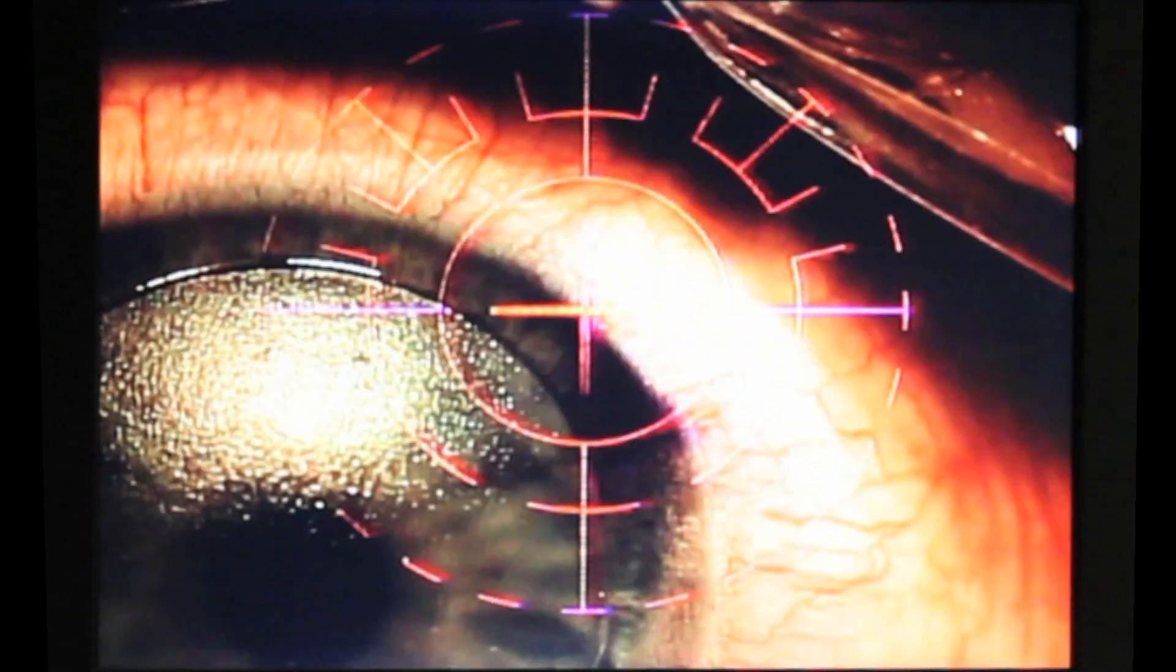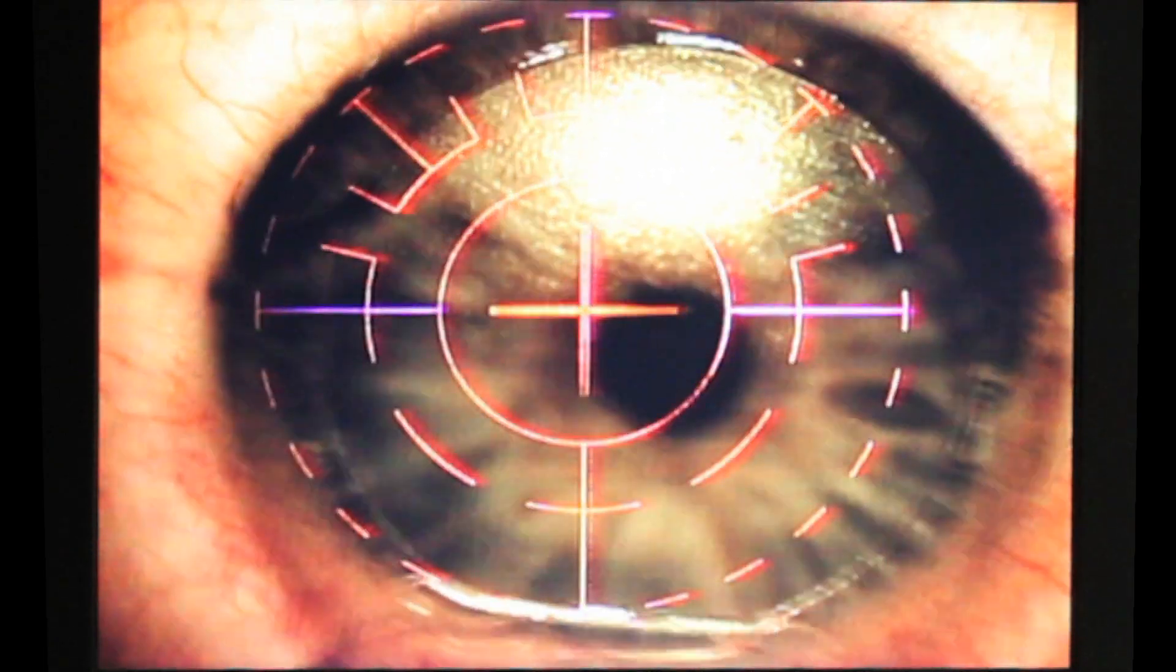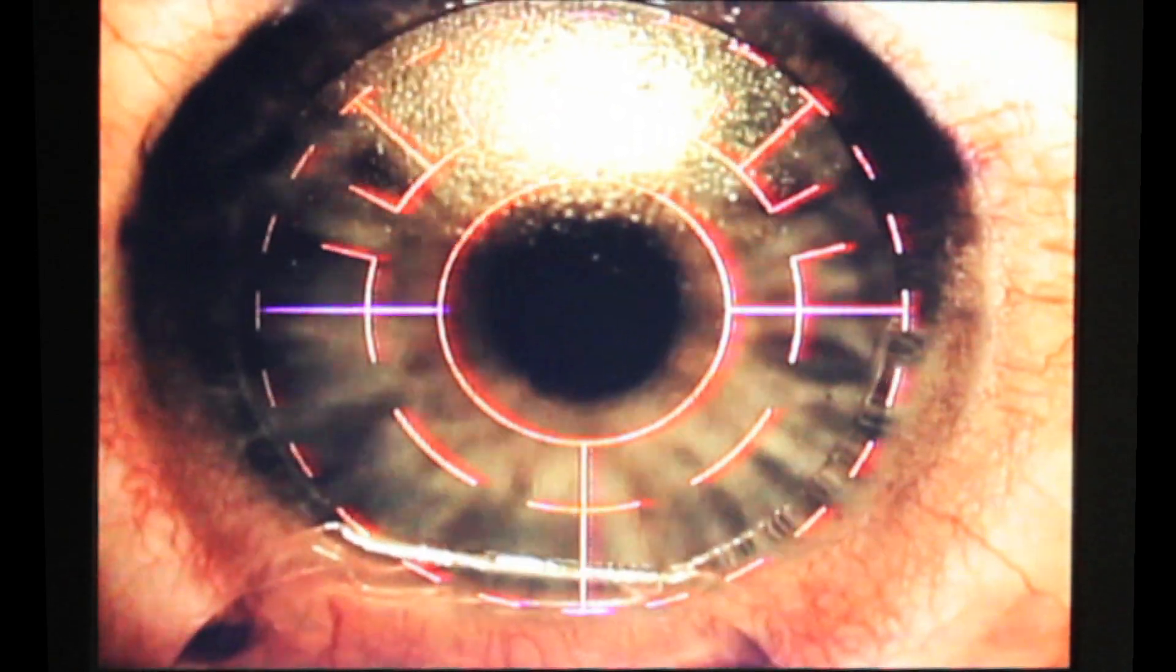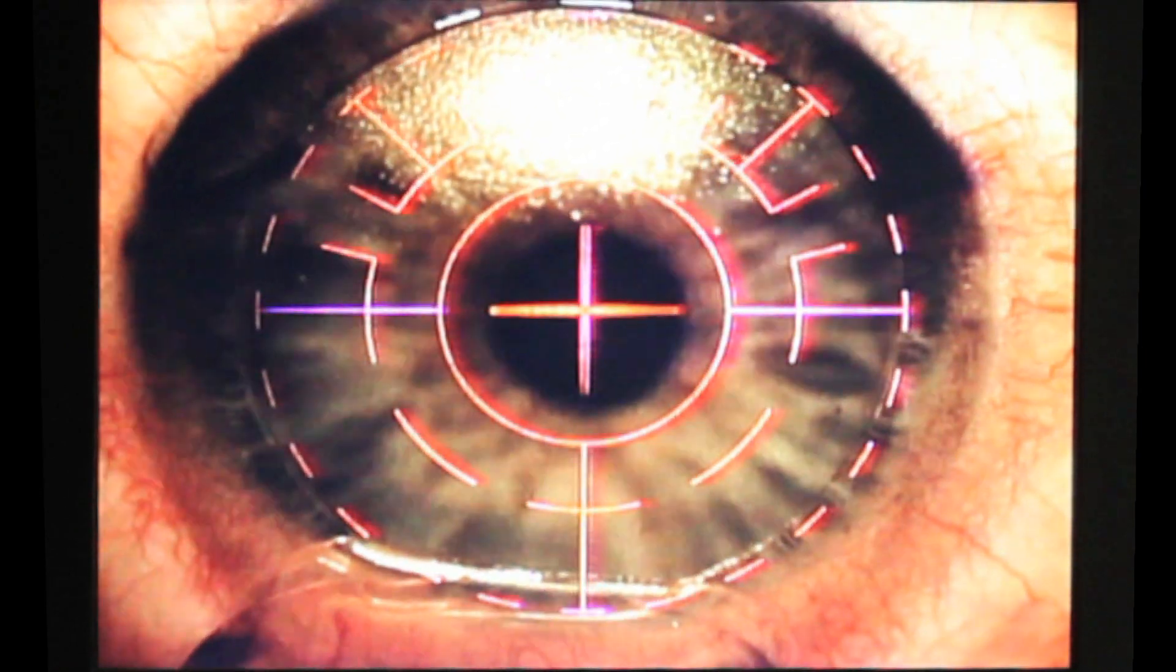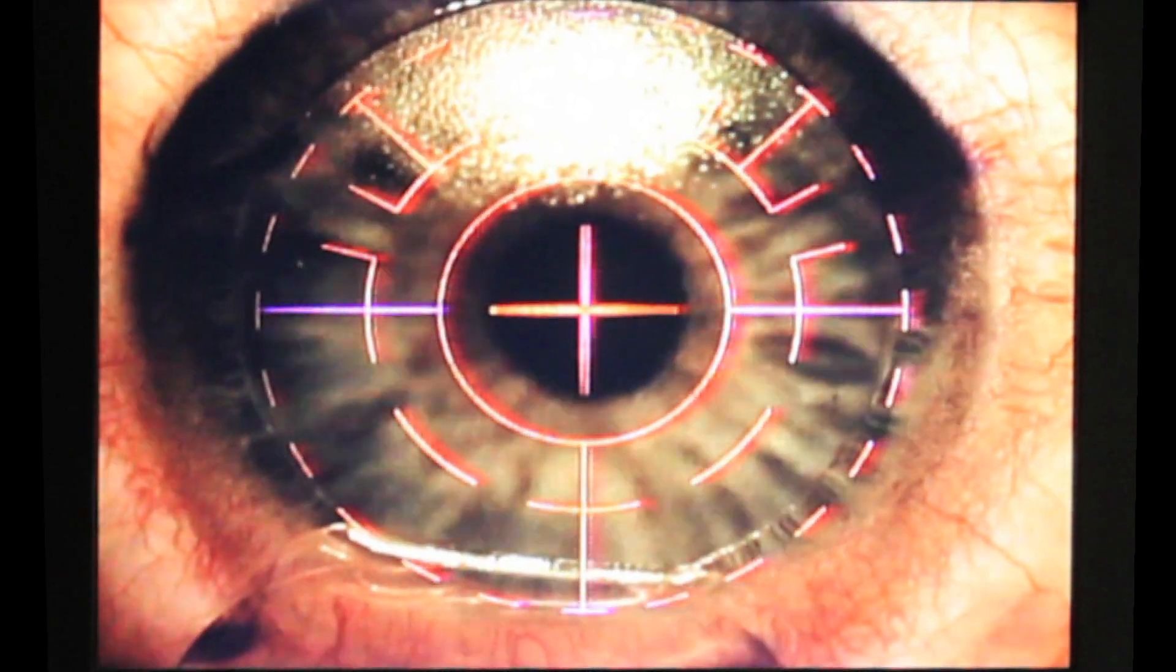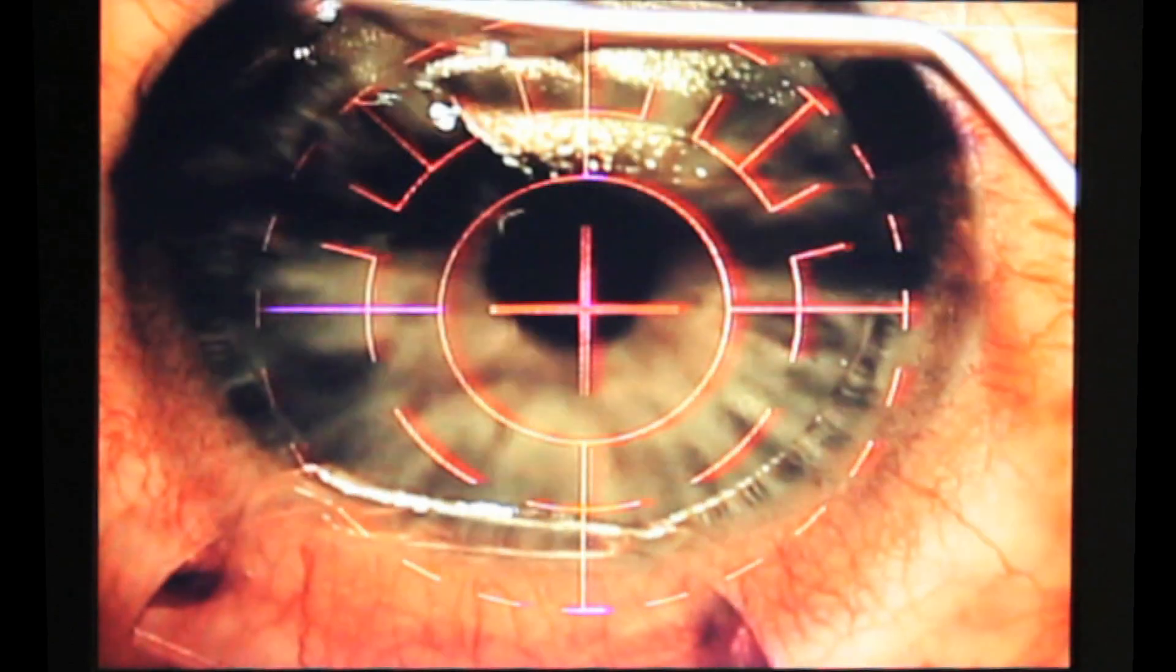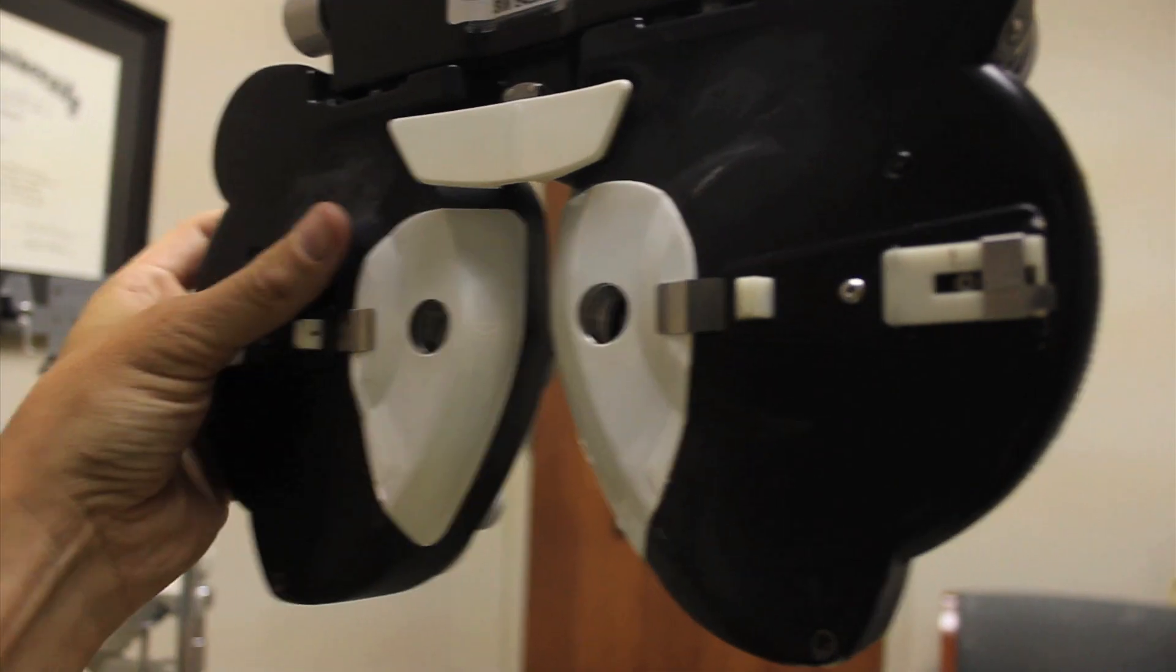The noise at that point is like a clicking noise. You can see he didn't acquire, so he had to walk back on and acquire. But it's like a tapping noise that you hear while this is going on. You can actually see the laser there. I don't know, it's like a bunch of sparks that you hear. See a little smoke? See that smoke? Anyway, that's that.